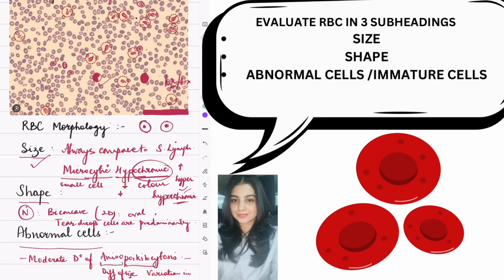So what is the diagnosis here? It will be a microcytic hypochromic picture with predominant teardrop cells. Okay, teardrop morphology. When you say teardrop morphology, automatically the physician or clinician or hematologist will think about thalassemia and further investigations will be carried out.